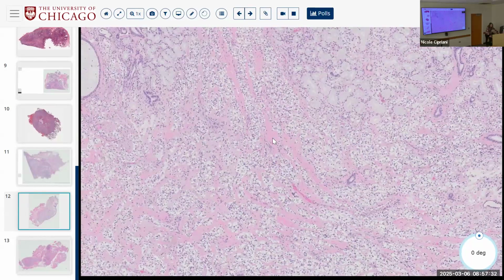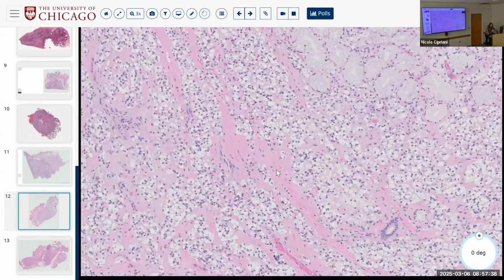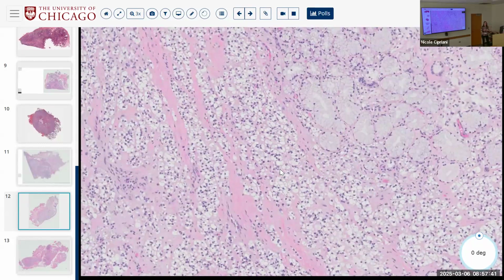Along with one of the characteristic features of this tumor, hyalinized stromal cords. So this is hyalinizing clear cell carcinoma, right? So your differential diagnosis might be a clear cell myoepithelial carcinoma. What we already saw, epimyoep, but for all intents and purposes, there's no epi here.